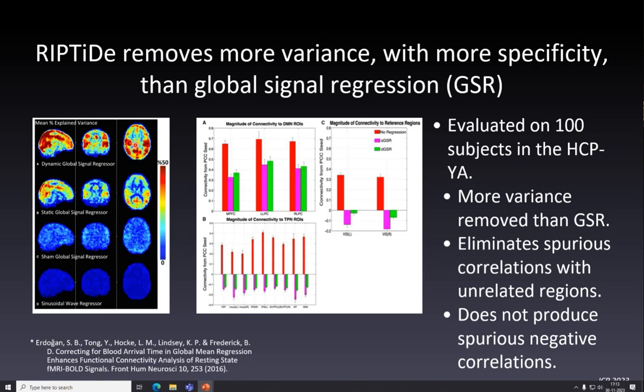this low frequency signal I'm talking about. The highest frequency in this signal is 0.15 hertz, right? So it's about a 6-second period. It takes about 6 seconds for blood to get through the brain. So if you take a bunch of signals with a highest frequency component of 6 seconds and you add them up in sort of a Gaussian histogram, it's going to look a lot like the original signal. It's just going to be a little blurry.